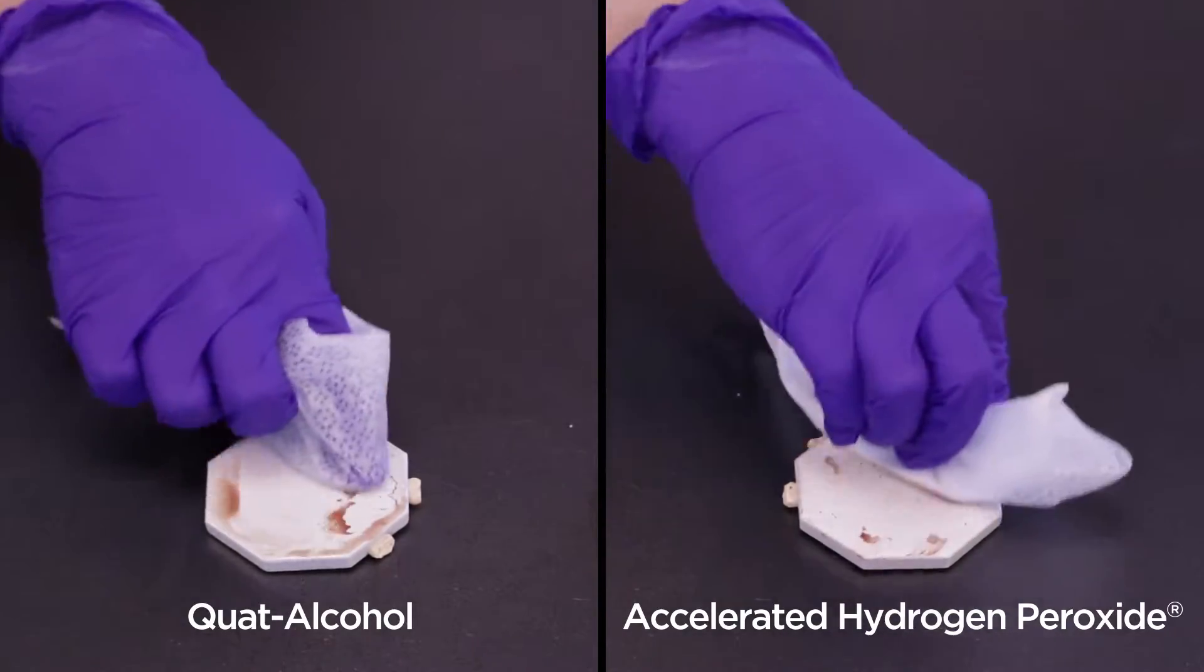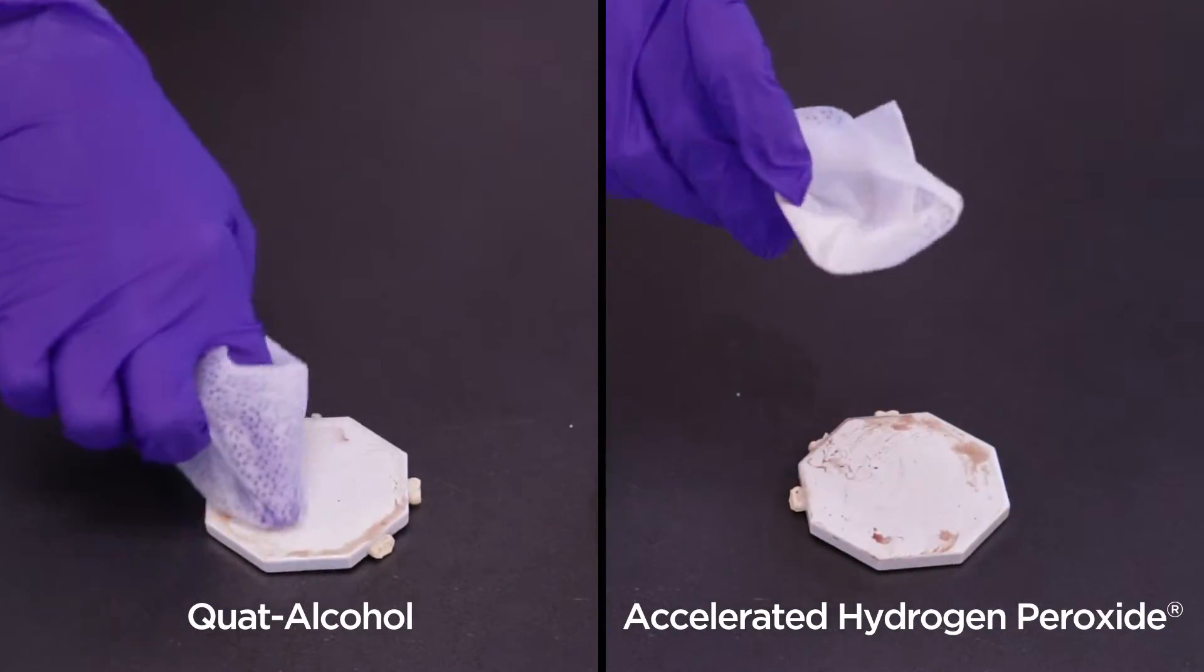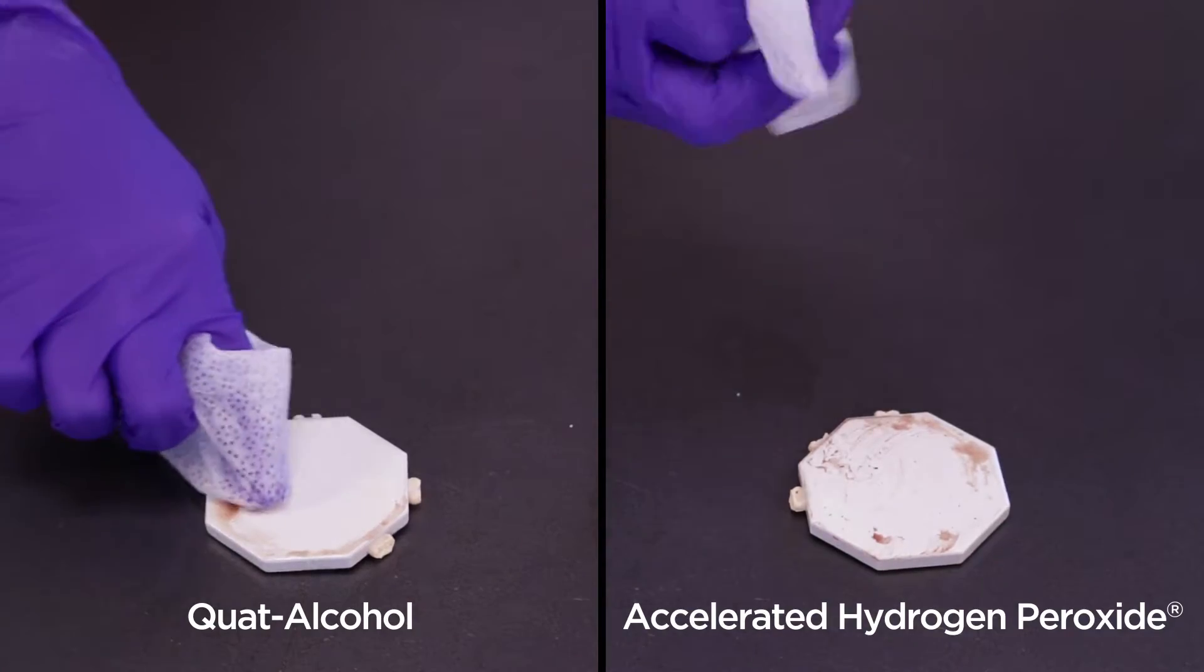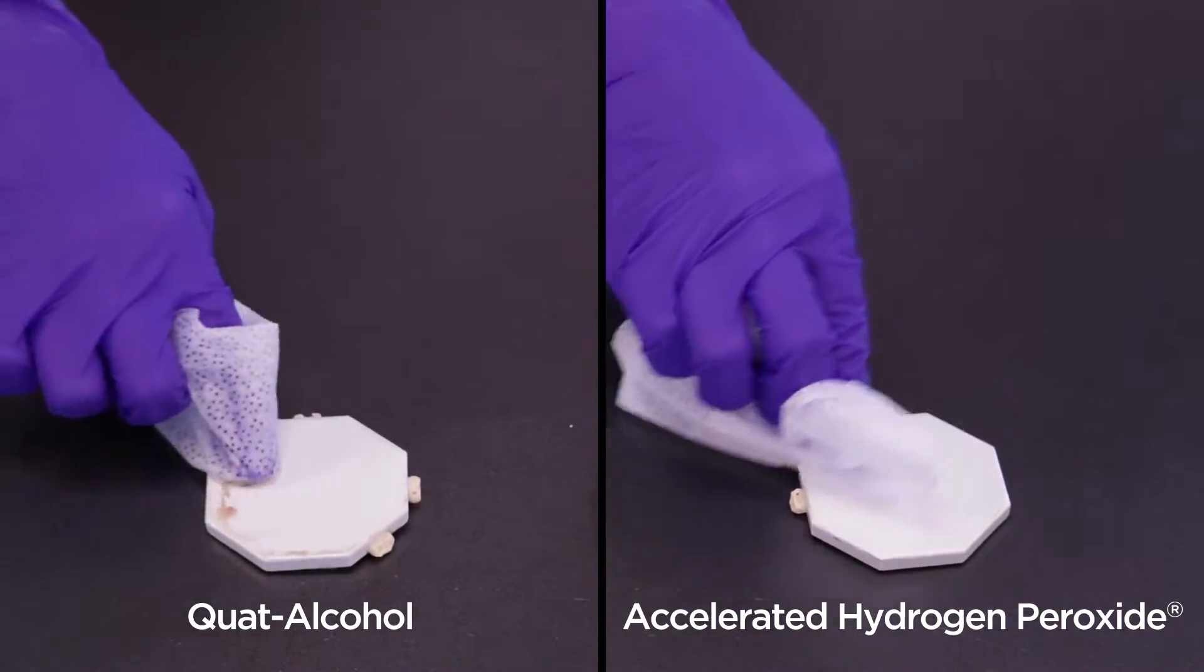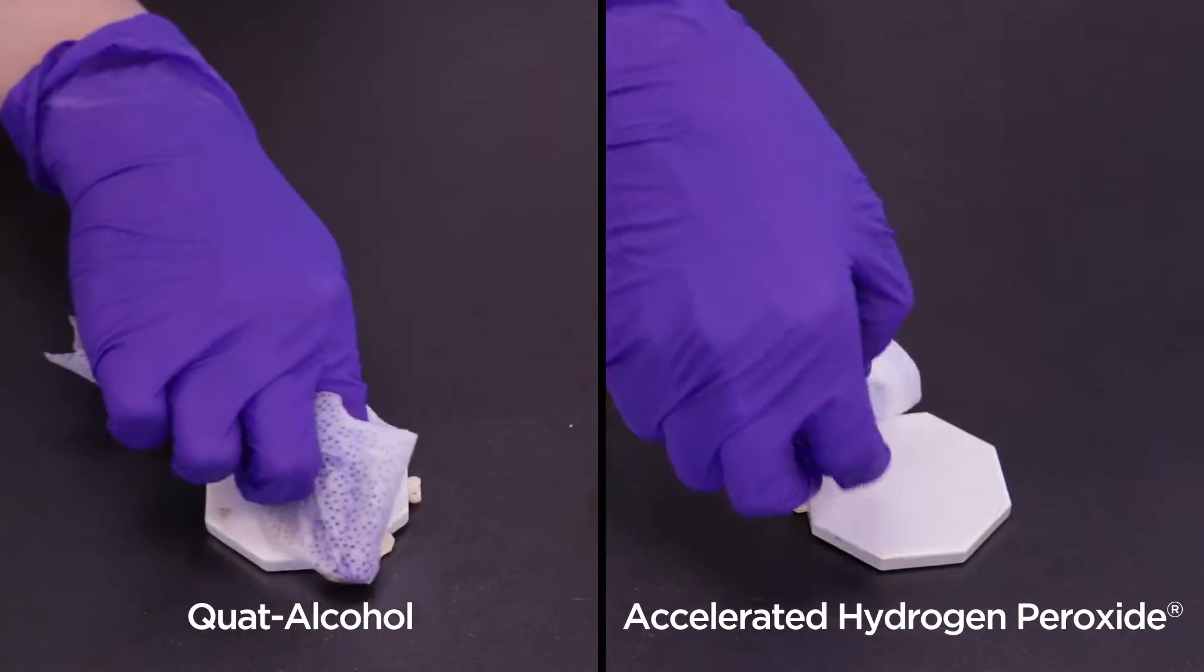Hemostyx reacts to the presence of blood through the detection of hemoglobin. The detection of hemoglobin will result in a positive reading. No detection of hemoglobin will result in a negative reading.